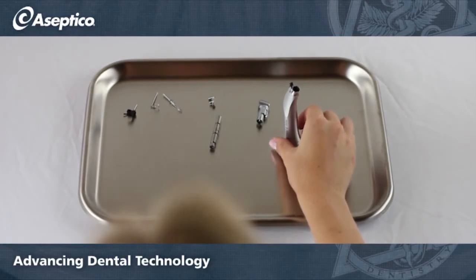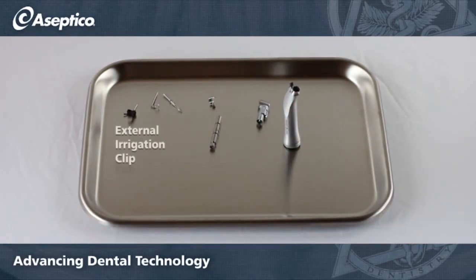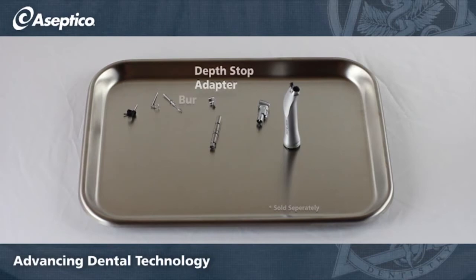With your handpiece disassembled, you'll have: an external irrigation clip, depth stop, burr, depth stop adapter, drive shaft assembly, head assembly, and the body of the handpiece.